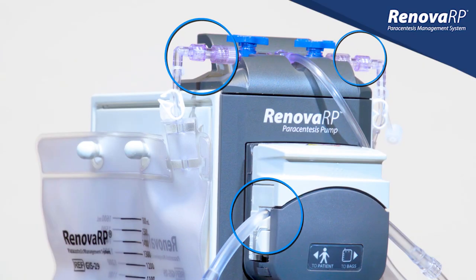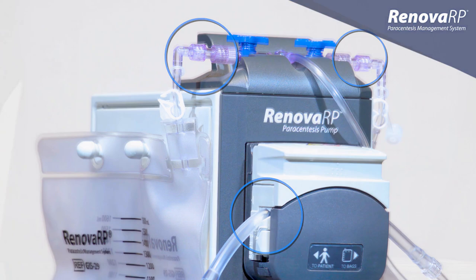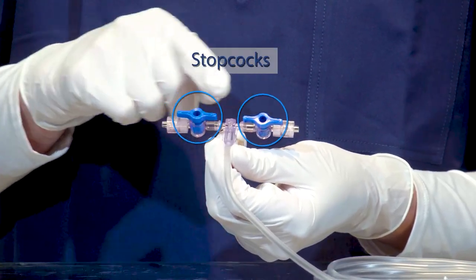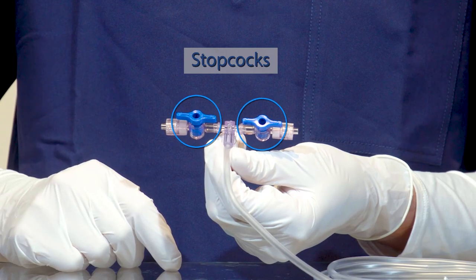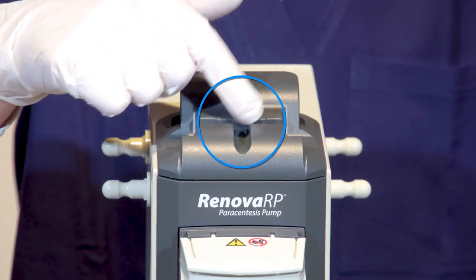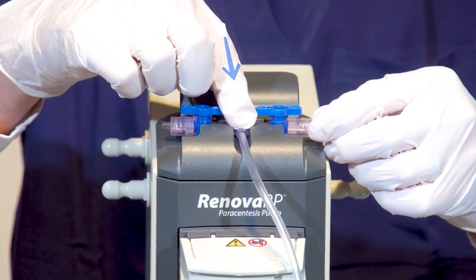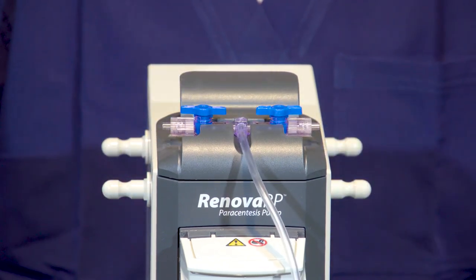Proper loading of the Renova RP Tubeset and connection of the Renova RP Drainage Bags are two of the most vital parts of system operation. One end of the Renova RP Tubeset features a pair of stopcocks and is in the shape of a T. This T-connector fits into the recessed area at the top of the pump. Press down firmly at the center of the T-connector to ensure it is properly seated.